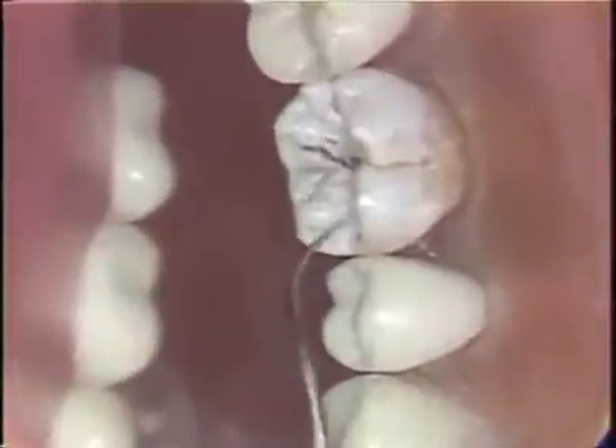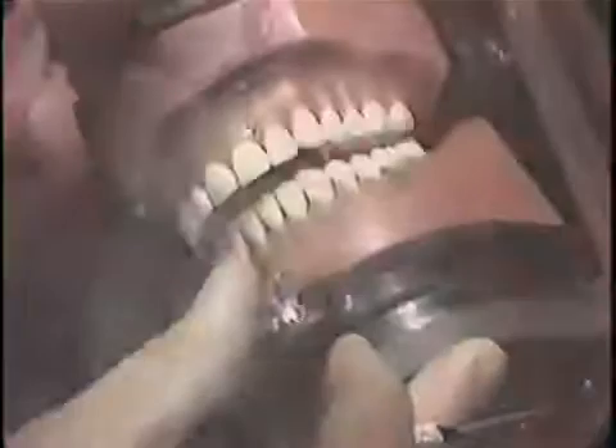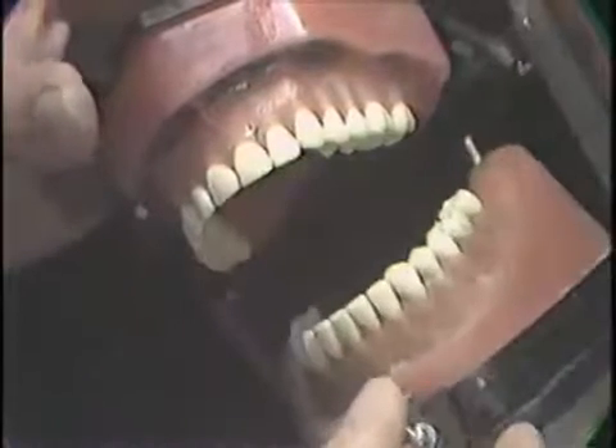Mount the supplied natural bicuspid or molar tooth in the visodont so that previous restorations and caries are at or above the rubber gingival shroud. Make sure that the tooth is in occlusion. Check working and balancing occlusion.